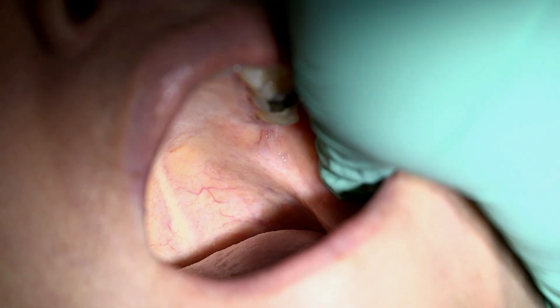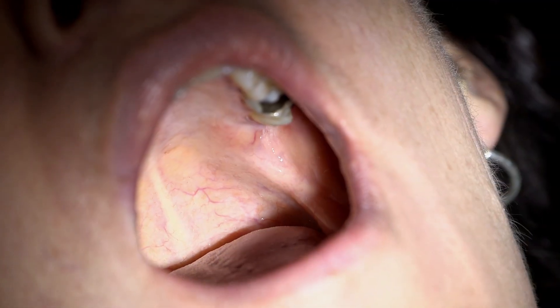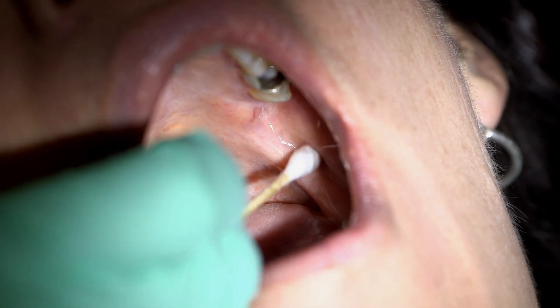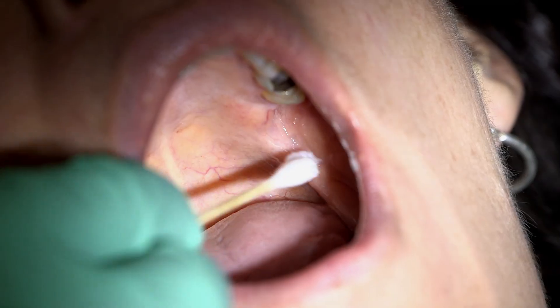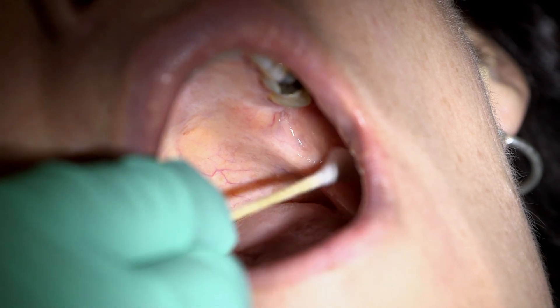Before administering the injection, we will apply topical anaesthesia. Firstly, we will dry the tissues, then we will apply topical for 1-2 minutes.